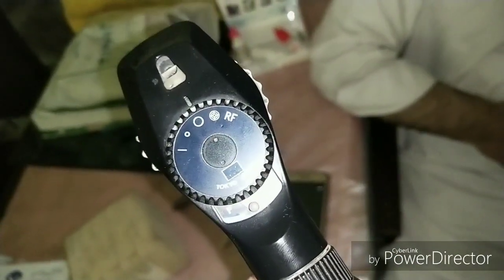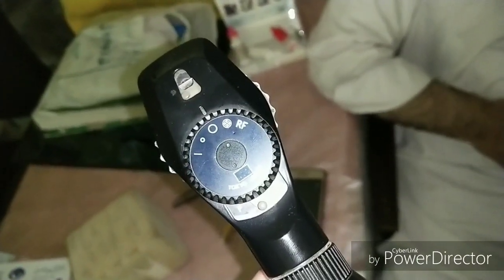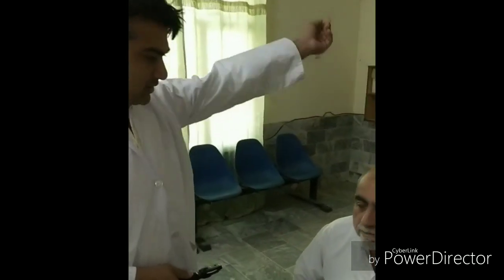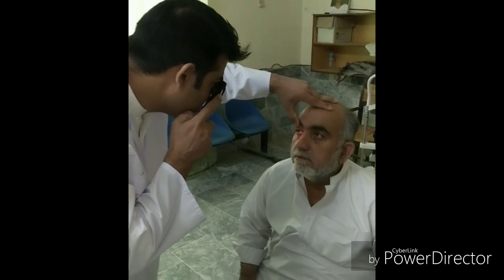For the examination, you should use the right eye–right hand and left eye–left hand rule. This means the patient's right eye should be examined with your right hand holding the ophthalmoscope, and the left eye with the left hand. Now the scope is in my left hand, so I would like to examine the patient's left eye. You should also remove the glasses of both the patient and the examiner, and the eye should be very close in contact with the fundoscope to get a clear image.